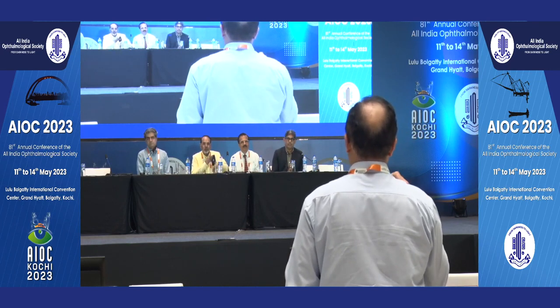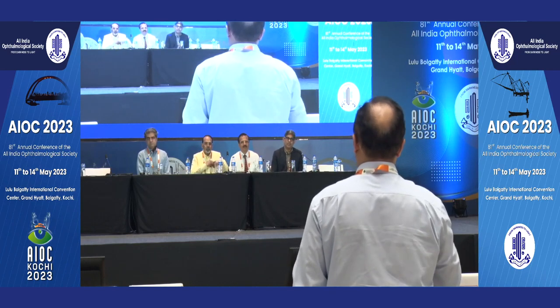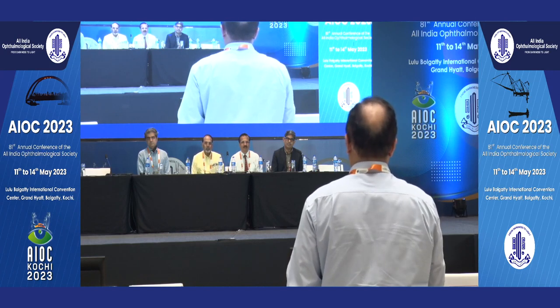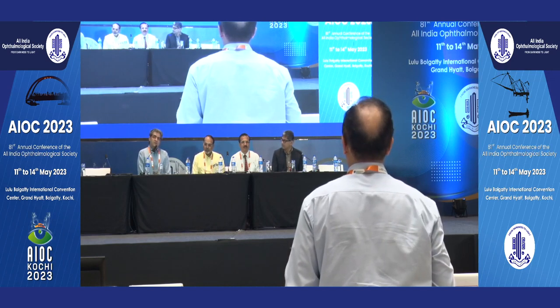So I have started marking a toric lens in the exact place where I want it, and then I see whether I get the Callisto when the patient is on the table. What I want to ask the panel is, if you're using Callisto, do you have a system where you can know in advance that the Callisto will not register on a particular patient when they are on the table? As I said, the IOL Master 700 has a camera.